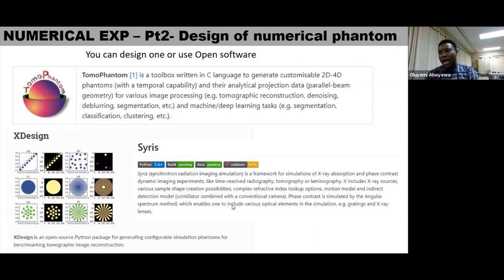But just to say, if we're looking at the dosimetry aspect, every technology has pros and cons, so we're going to have some disadvantage. But to be frank, there are a lot of repeated CTs done even with the conventional CT we do right now. For instance, if you're doing radiation therapy and you want to do a form of adaptive treatment, you have to image the patient again. You do that during your CT setup, during your simulation, and also during treatment for patient setup. So we're not just imaging the patient once, even right now with the conventional CT.